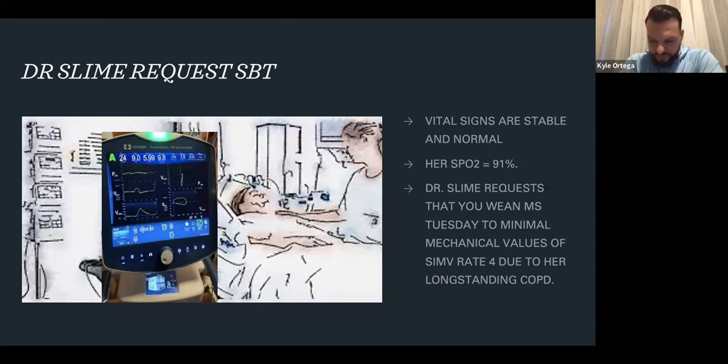All right, Miss Tuesday, now I'm gonna explain how to get that vital capacity and that NIF from her. Remember how I said I need to get some numbers? So what I need you to do now is take a big, deep breath in, as big as you can, and then let it all the way out, okay? And that's going to be me measuring her vital capacity. What I'm going to do is wait and synchronize it with her chest rise and fall. I don't want to tell her to take a bigger deep breath when she's already inhaling. Wait till she's exhaling and then start on that next inhalation.